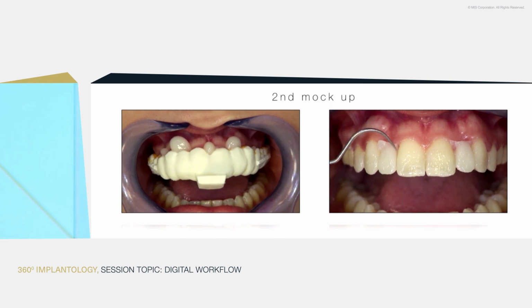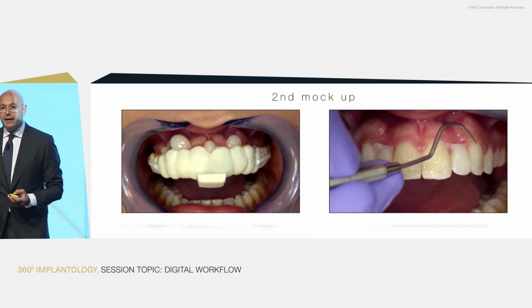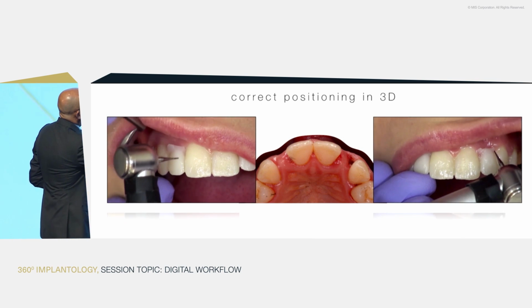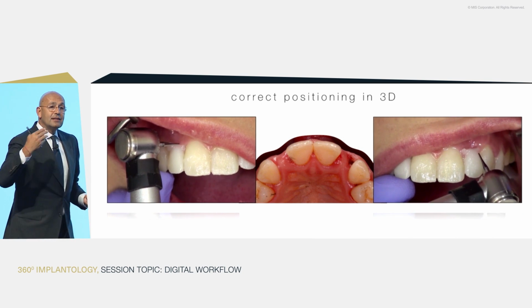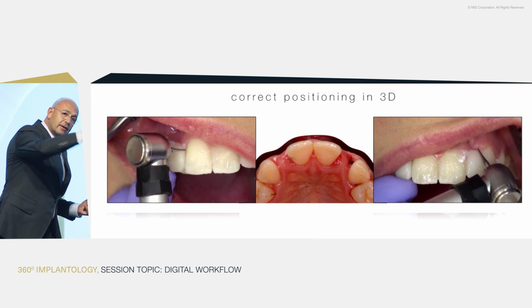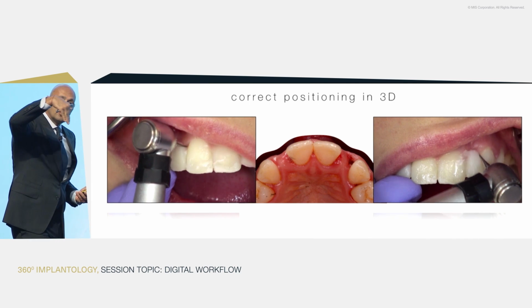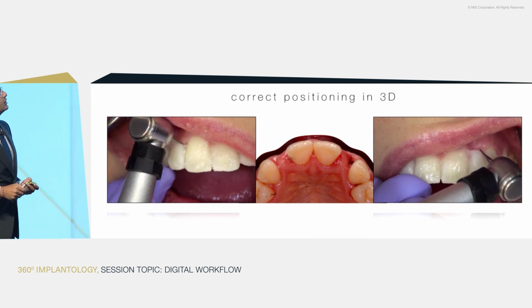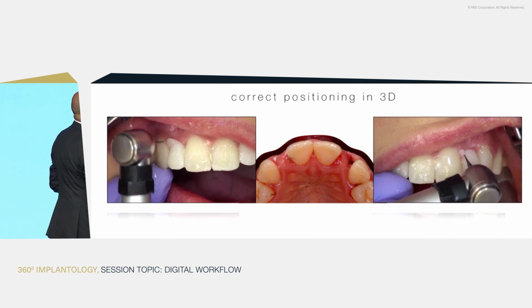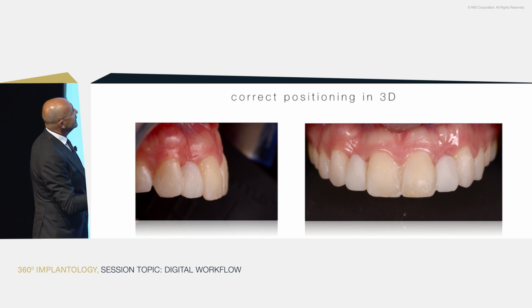It looks wrong. What about this area? Why were all the margins perfect, but the laterals were not? It's simply because of this depression here. We didn't position the crown or the wax up inclining out, but we uprighted the root so the tooth becomes into its correct position. So what I do here is that I try to clean up the excess in that zone, and when I finish it, this is what I see.